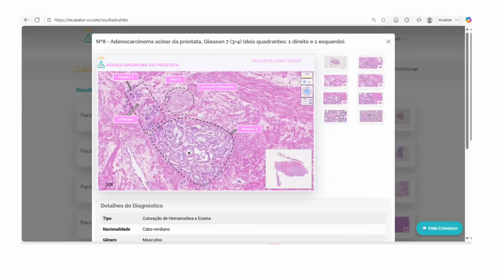You can study the pattern of tissues. You can do the diagnosis remotely. It's very important. You can annotate and share digital slides, and the big importance of this is to support medical decisions via remote consults and second opinions.